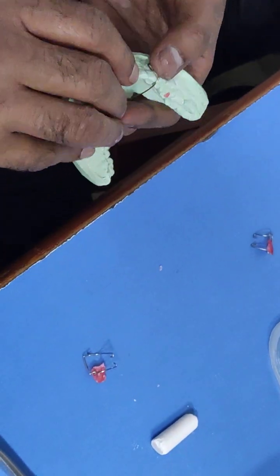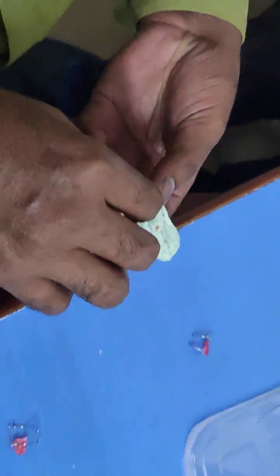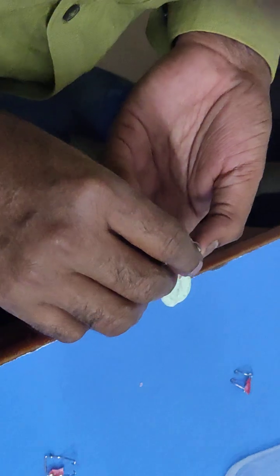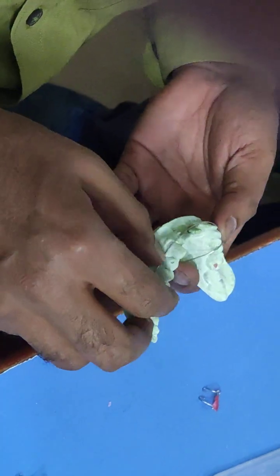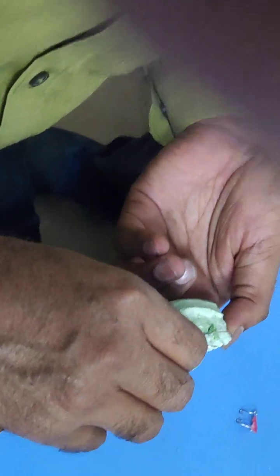So if you make a bend including first premolar, then you also need to include the opposite side second or first premolar, not the canine. Okay, so it is not that on one side canine and on the other side premolar. Okay, it has settled here, no problem.